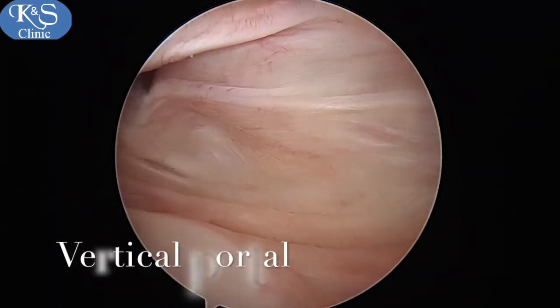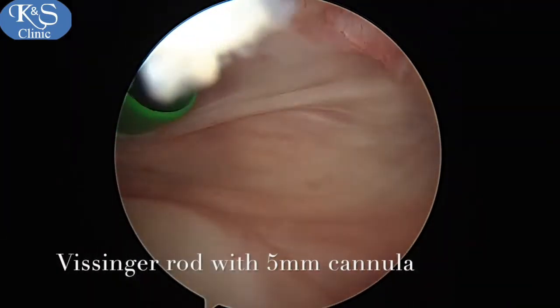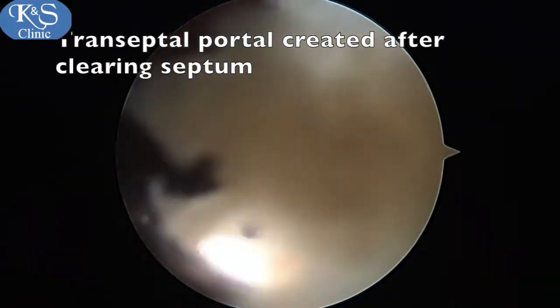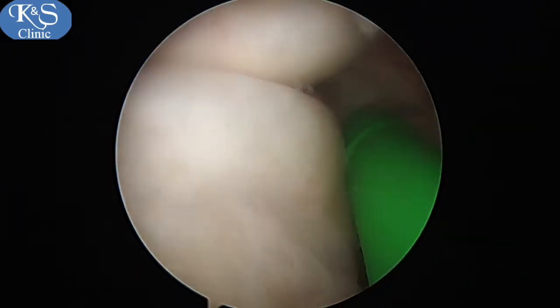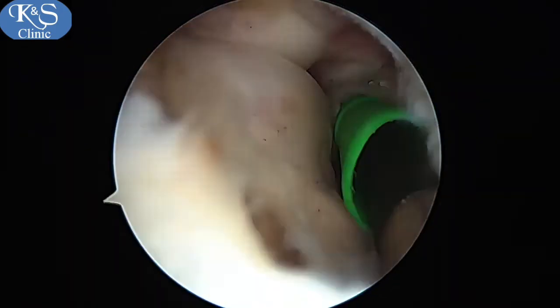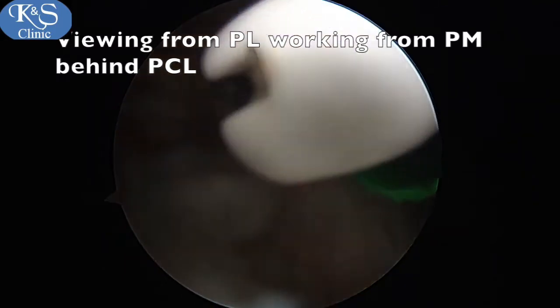A switching stick is introduced, over which a cannula is threaded. A transeptal portal is then created after clearing the septum from the notch. Not all surgeons may do this — it is technically demanding but gives you better visualization of the back of the knee and makes the PCL reconstruction a lot easier.